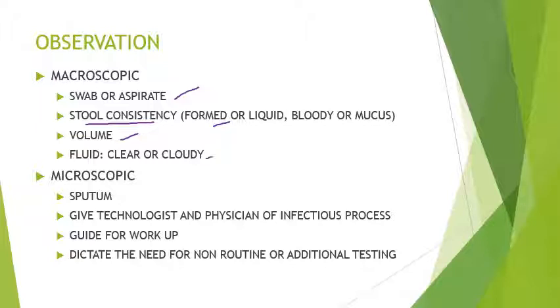Any body fluid must be checked if it is clear or cloudy. Minsan makakakita kayo ng urine sample na parang contaminated with stool. So, pwedeng i-check yun. Okay? Another, microscopically, you can actually see sputum sample. Remember the Bartlett's criteria? It is less than 10 epithelial cells per low power field and greater than 25 WBC or neutrophils per low power field.